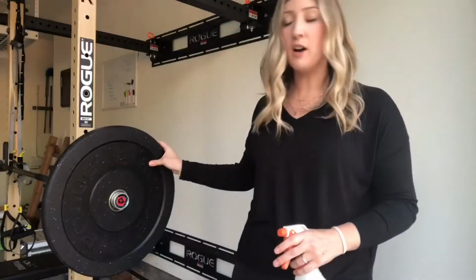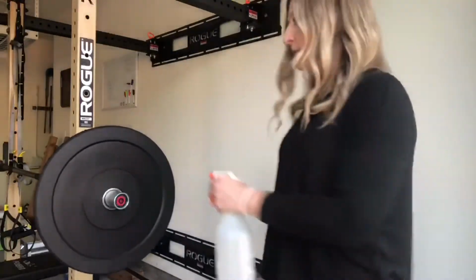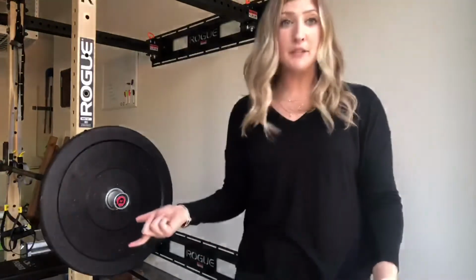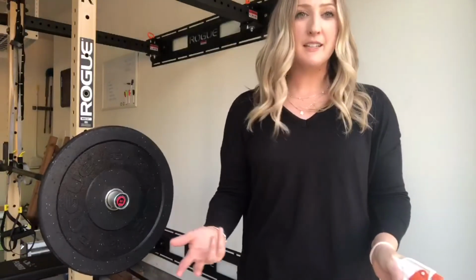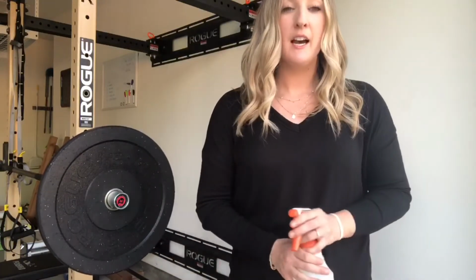So when we have a target that's standing still and we fire our electrons, it's gonna hit in the same spot every time, causing what we call pitting. Now, if we have a moving target and we fire our electrons, it's gonna hit in a different spot every time. What this does is it's gonna spread out the heat and increase our surface area of the target and will eventually prolong the life of our tube.